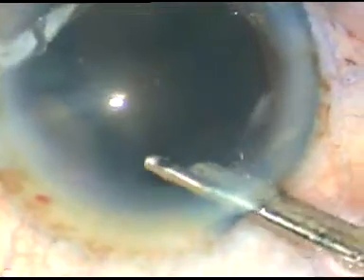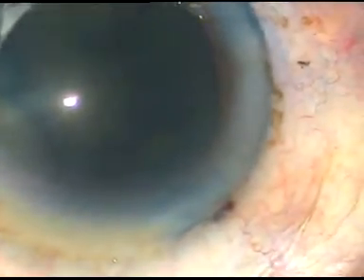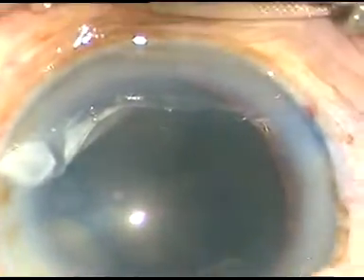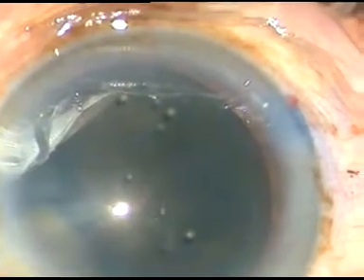The nucleus sclerosis of this cataract is about grade 5 or even more. By this time the incisions have been made. The capsule has been stained with trypan blue dye, and now viscoelastic substance — 2% hydroxypropylmethylcellulose — is injected into the anterior chamber.